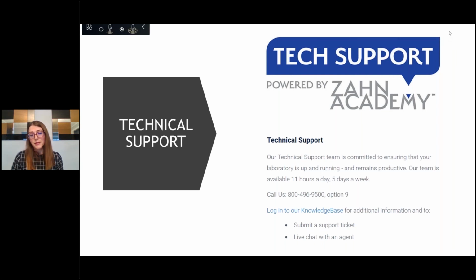Great, and the next one is, how do I determine which is best for my current situation? So that's definitely not a one-size-fits-all type of setup. It really depends. I say to communicate with your technical support team, communicate with your IT, and support team is willing to work with your IT directly so that we can come up with what's best for you, right? So if you're a small one-person lab and you're doing this remote work temporarily for a couple weeks because you have to quarantine, or you're trying to catch up on extra work in the afternoon, probably the fastest and cheapest way is to just, if you have a laptop, have a local install, bring the dongle with you, or use the remote access.